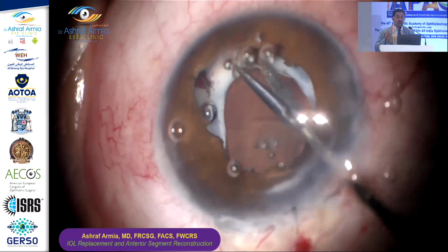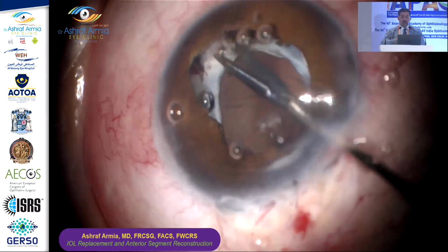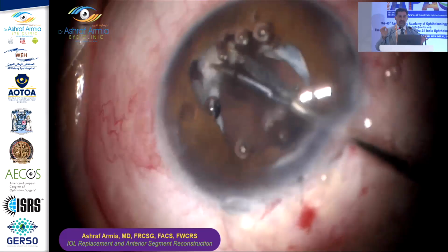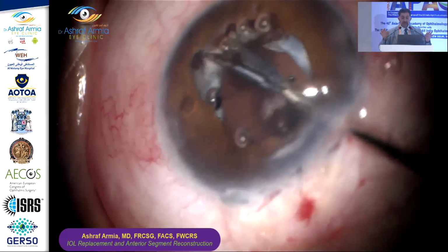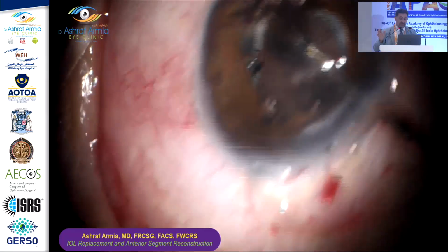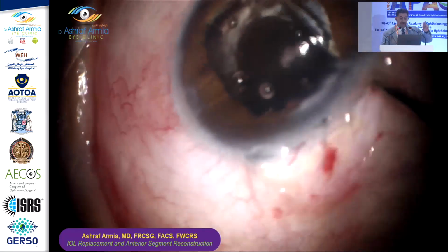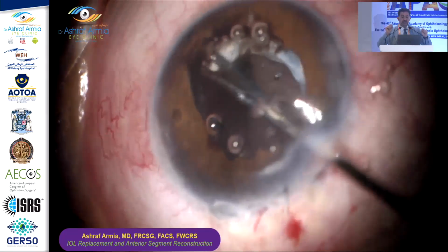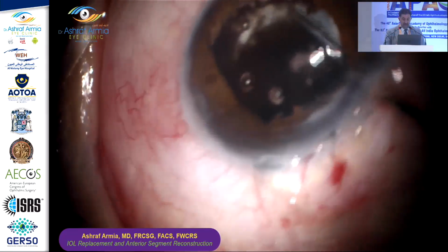Now I'm trying to milk the iris and also to find a space, because I like the sulcus. I will maintain the bag also, in spite of the posterior capsule not being present. There is vitreous. I did a posterior anterior vitrectomy for the case, but I'm trying to open a space in the sulcus because I think that I'm going to succeed to implant in the sulcus.